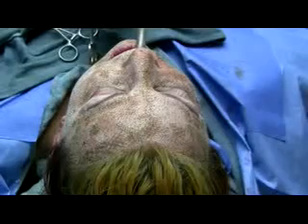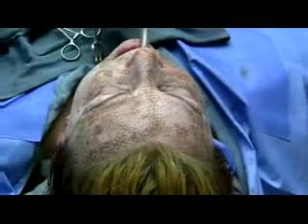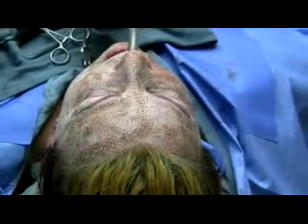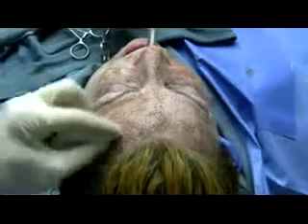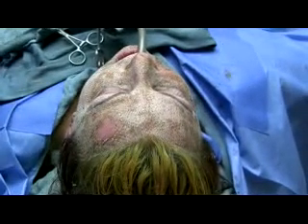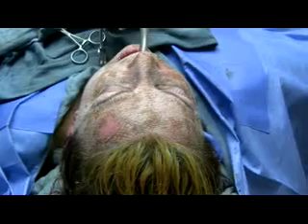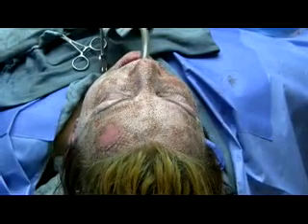Since we don't debride between passes with the gauze like we used to, things heal quicker. You know, we used to debride each time we did a pass. And the problem is you do laser, which is very controlled, and then you're dermabrading that skin with a wet gauze. So that really increases the pain and the erythema. And I think one of the tricks to managing laser resurfacing patients is to make the procedure as easy for them as you can. And that's the point of another lecture.